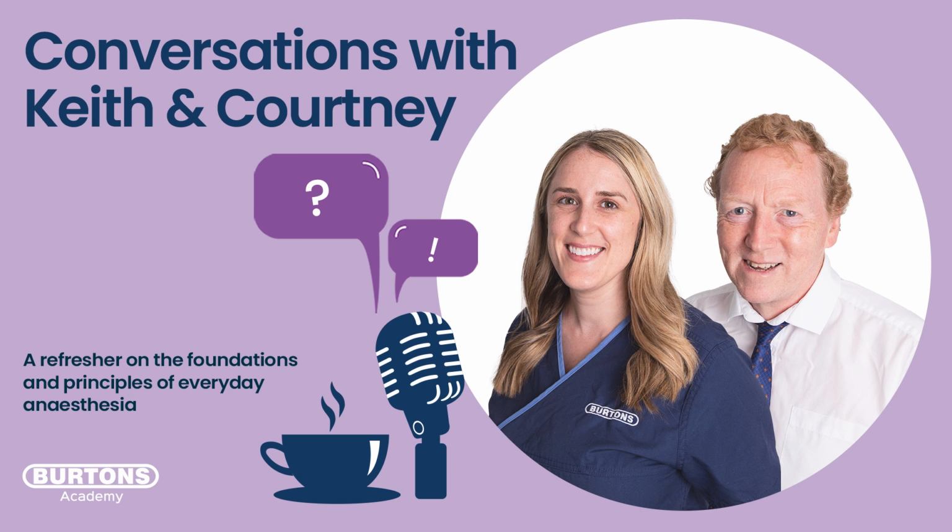But in your instance where you see that 87% saturation, you think, well, why? Why would that be the case? You glance over at your anesthetic machine and you see that the oxygen value coming out from your analyzer is now 58%, because something has affected it, either there's a leak between the concentrator and the delivery, or there's some other gas being introduced, just as you explained. Really easy to put one of those in.